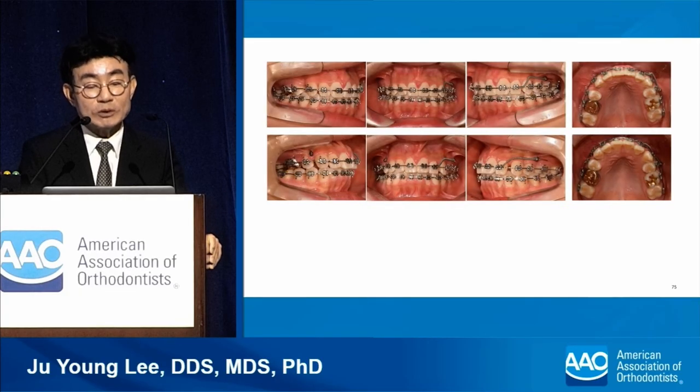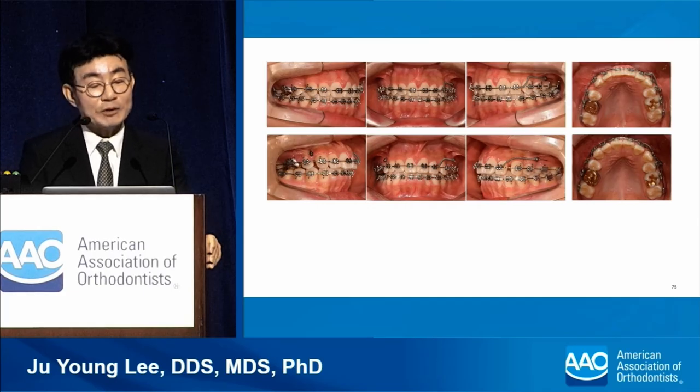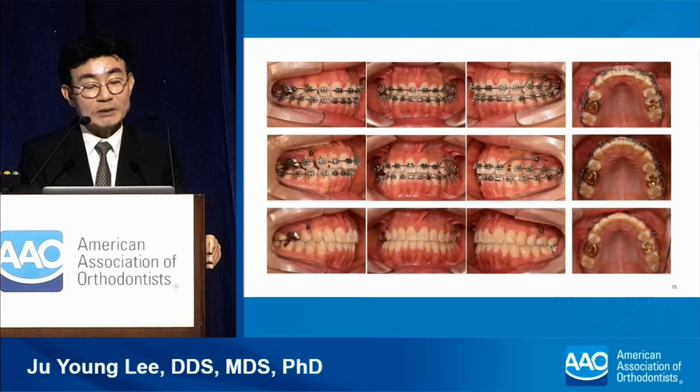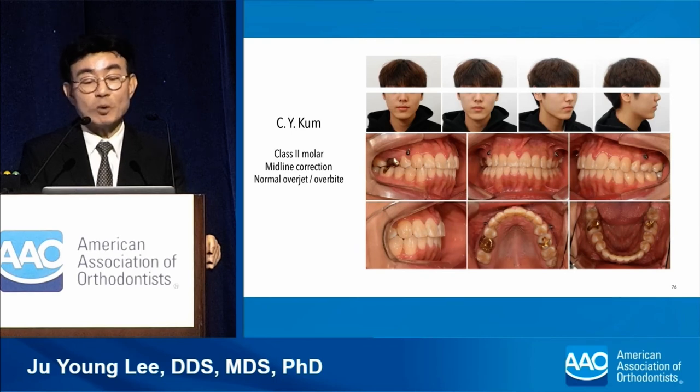Since the overjet was small, the midline was improved by pushing the upper anterior teeth with lead spring. The midline finally coincided. The treatment was completed after moving the posterior teeth mesially. In this case of extraction of only maxillary premolars, it was important to form enough overjet for long-term retention. Enough overjet was easily formed using the pushing force of the lead spring, and the treatment was completed.